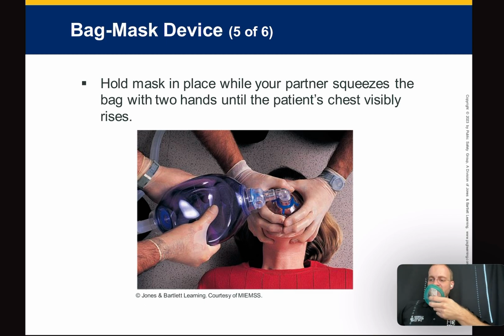And so the idea is to not just mash this onto a patient's face. You might be thinking, patients are lying flat, so I'll just mash this onto their face because that'll make a good seal, because you want this to seal so air doesn't escape. The idea is to lift the face into the mask as well, right? So you are pushing it down onto their face, but you're also lifting the face and the jaw into the mask as well.